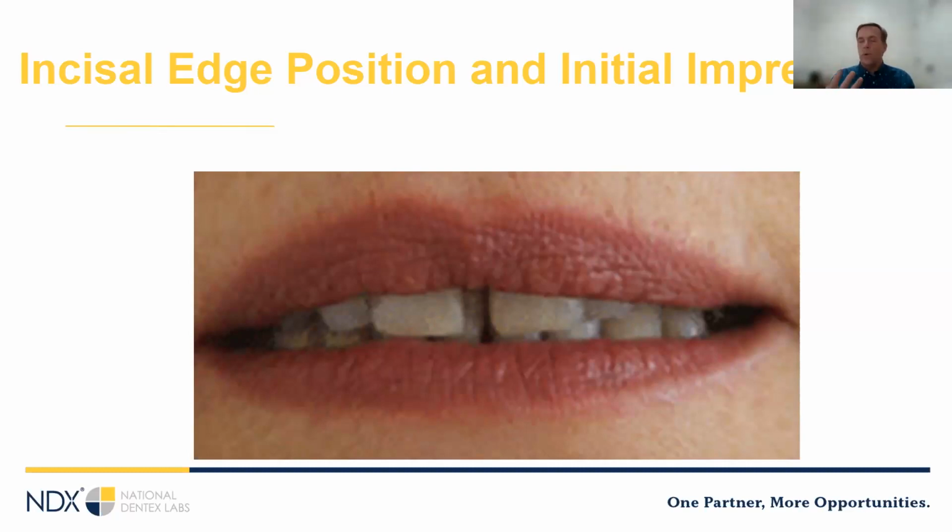Again, as we're restoring a lot of these cases, we'll find that we have space between the arches because we're trying to recreate the missing space. So once we get those incisal edges figured out, that shows us where our occlusal plane needs to be to build up the upper and lower appropriately.